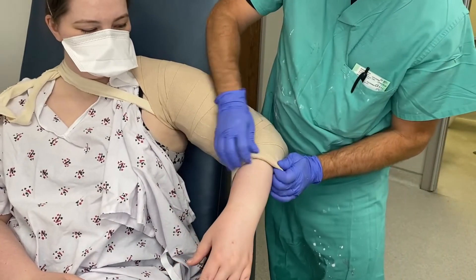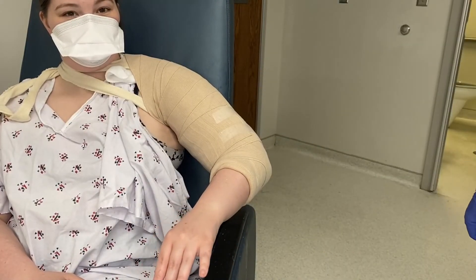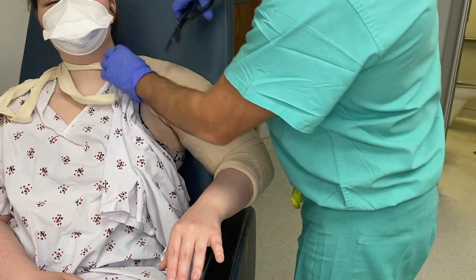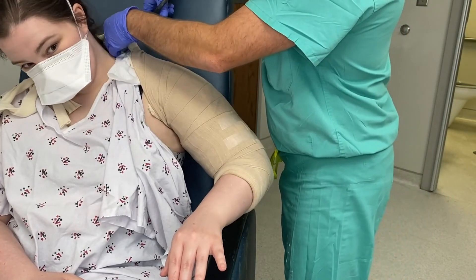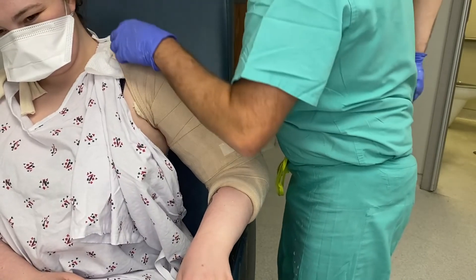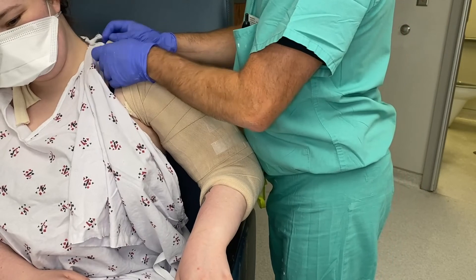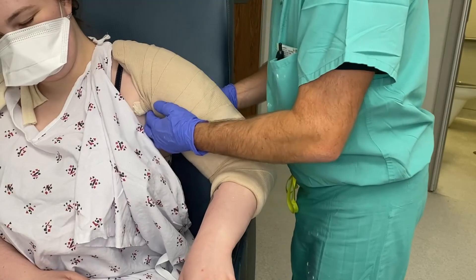Now the plaster has dried and you're ready to cut the straps off. Cut the ones in front — you can untie it if you want to, but I usually just leave it tied up and cut the straps. Have the patient sit up a little bit if you need to. Once that's done, you can take the ace wrap and fold it up underneath the plaster just to protect the patient's skin. Tuck it in and do the same thing underneath the armpit.